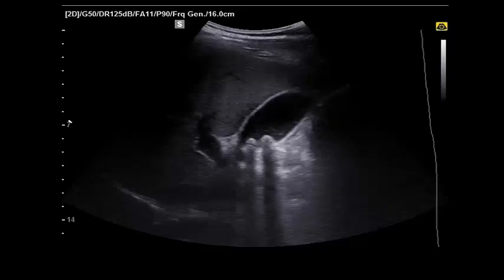Really, in this type of biliary pain, ultrasound is a very important investigation, and it is the imaging of choice in this situation. You will put the curvilinear probe in the 8th intercostal space, anterior axillary line, and in some patients you can put it between the anterior and mid axillary line. You will put it parallel to the space, and you can tilt anteriorly and posteriorly to explore all the area.